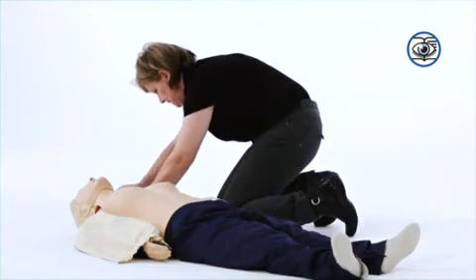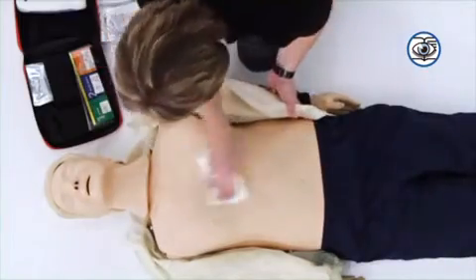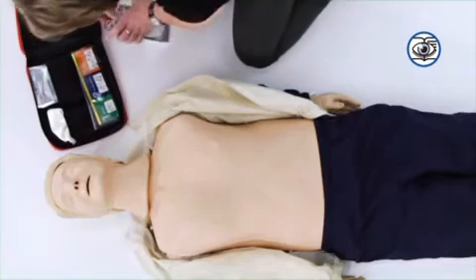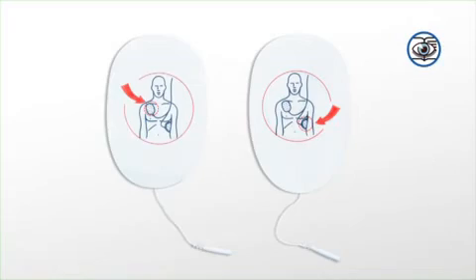If another CFR is present, let him or her perform CPR while you turn on and prepare the AED for use. Make sure the chest is clear and ready for shock pads. Remove defibrillation pads from their packaging. The packaging will often have graphic images demonstrating the correct position for placing the defibrillation pads on the patient's chest.